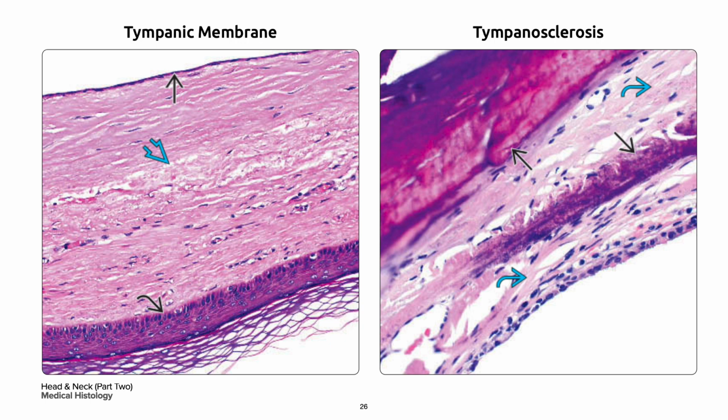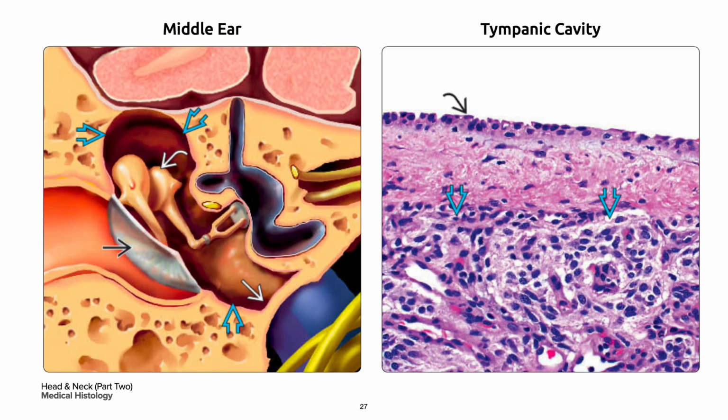irritation. On your right is a chronic injury to the tympanic membrane that can result in subepithelial sclerosis in curved blue arrow with secondary dystrophic calcification in a single black arrow known as your tympanosclerosis.